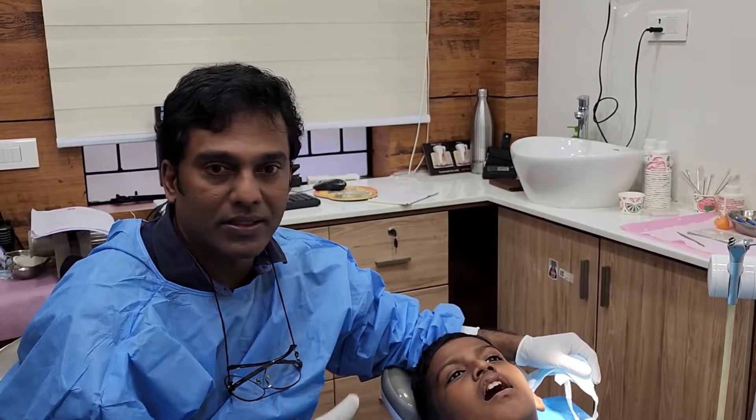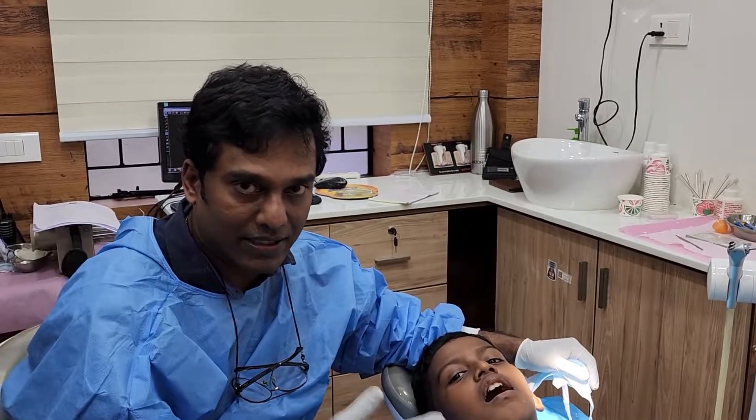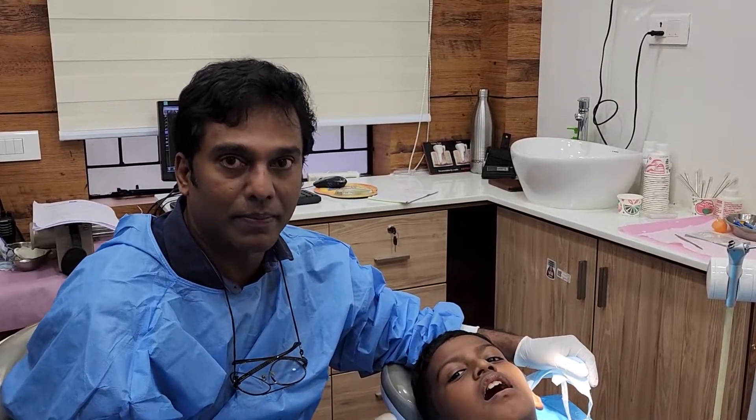All three of these together make it completely pain-free. Watch this boy who is being injected and his response regarding the pain.